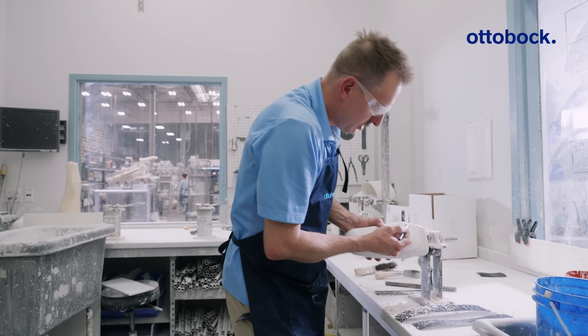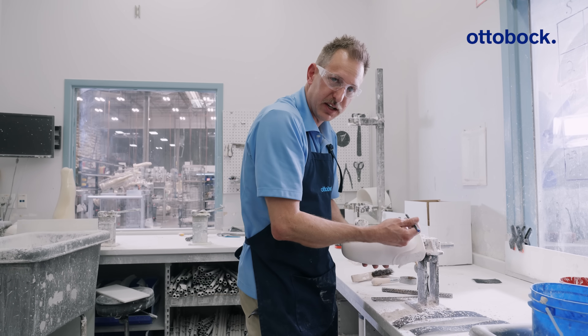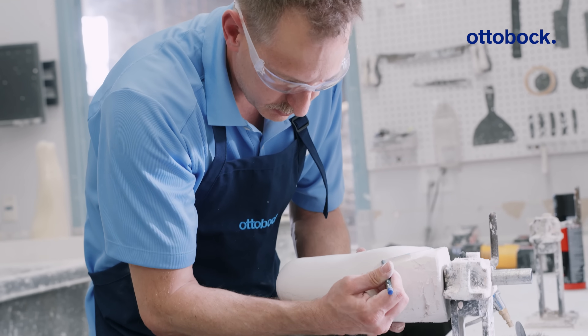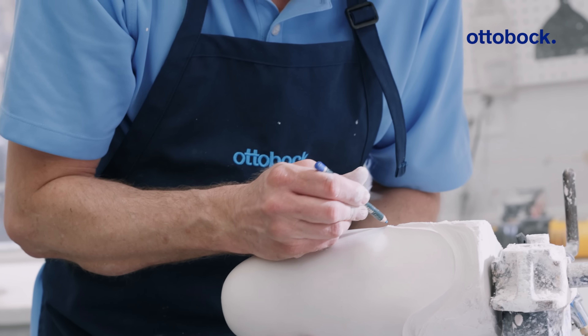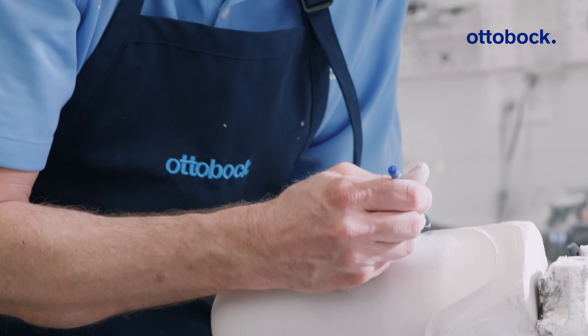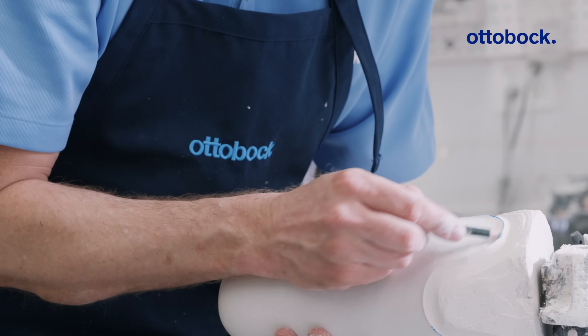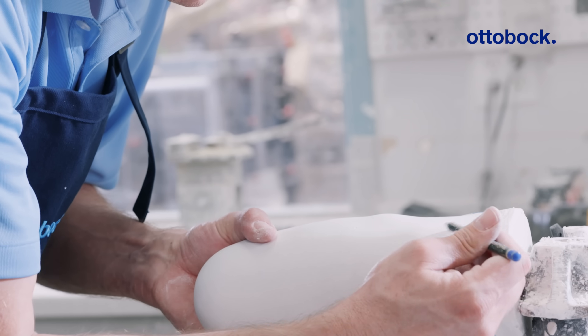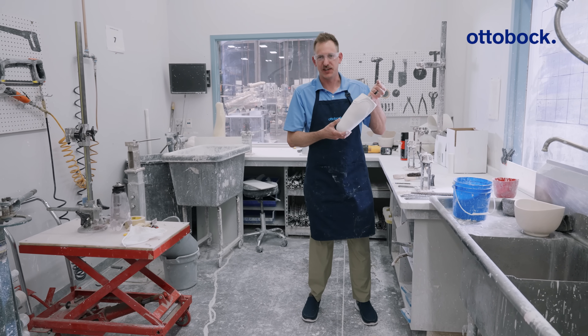Lastly, if you want to further define this — like if you're going to another check socket — you can color this in with your indelible marker right on that edge. Or if you are 3D scanning to transfer to a 3D printed socket, this is a good way to define those lines in your scan. And there you have it: very well defined trim lines ready for transfer.